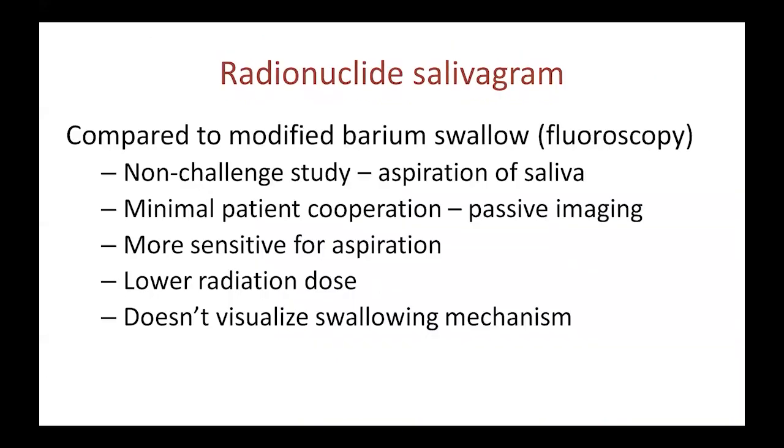When compared to a modified barium swallow performed by fluoroscopy, a radionuclide salivagram is a non-challenge test, right? It looks for aspiration of saliva, not for handling of administered food, and therefore requires minimal patient cooperation, only passive imaging after the drop of saline is placed in the mouth.